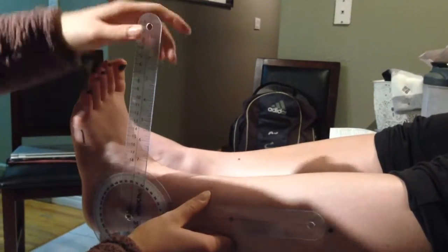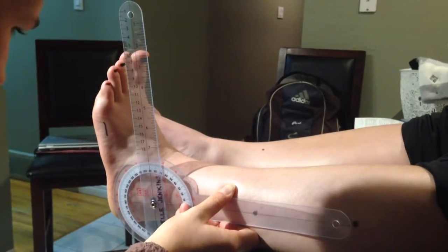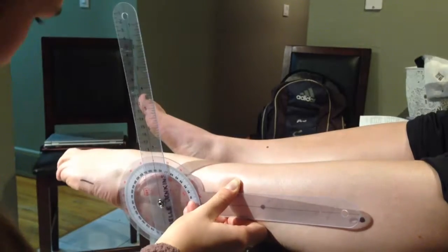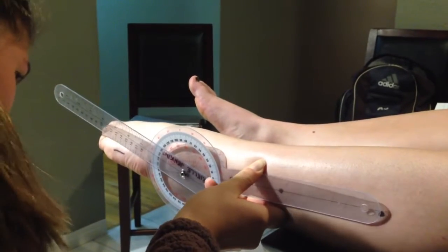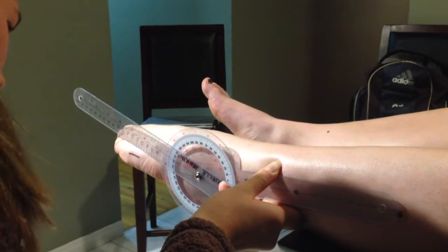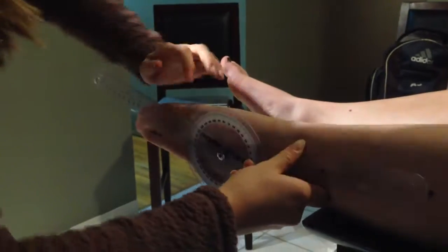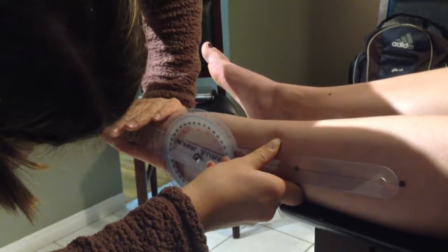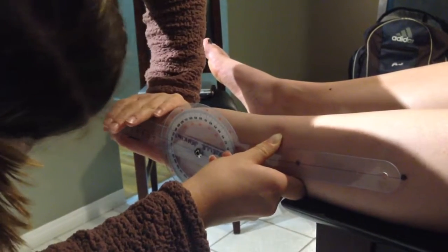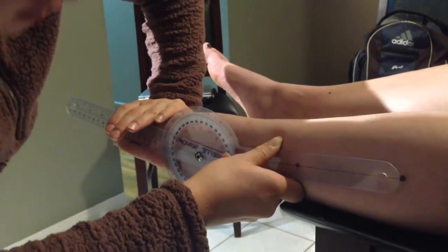Okay, and now I'm gonna go back to neutral. 90, okay, and can I get you to point your toes for me? I'm gonna say that's about 60. Normal for this is 50. Okay, and it is 66, and I'm going to apply overpressure to this because it's the uninjured side, and that looks to be about 70, and it is 75, and there's a firm tissue stretch and feel.